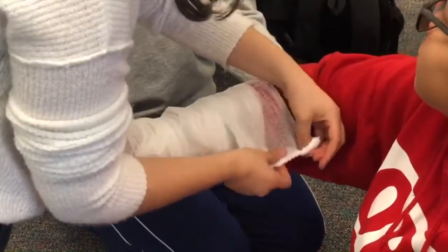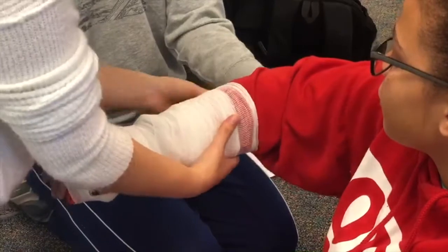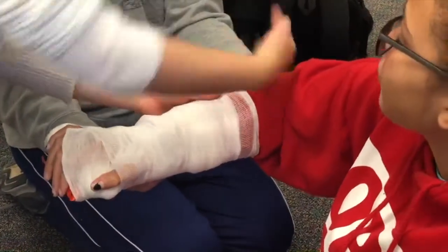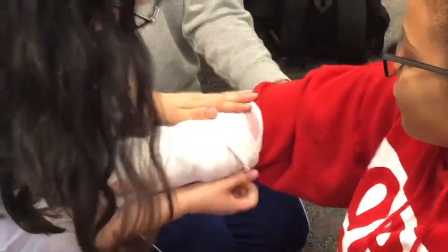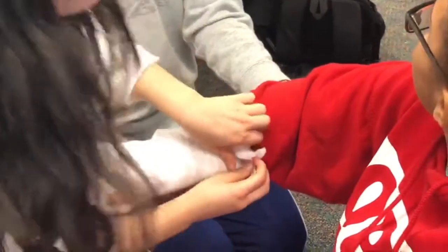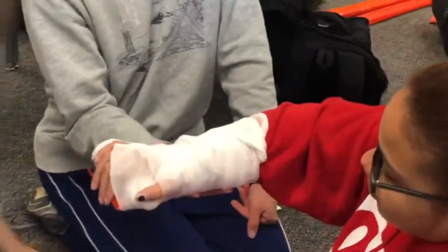It has to be wrapped around to the whole board. So if you end up not having enough, we're just going to pretend it's wrapped all the way up to the end of the board. And if it isn't sticking, just tuck it in — you can use another one. For the sake of time, we're not going to here.